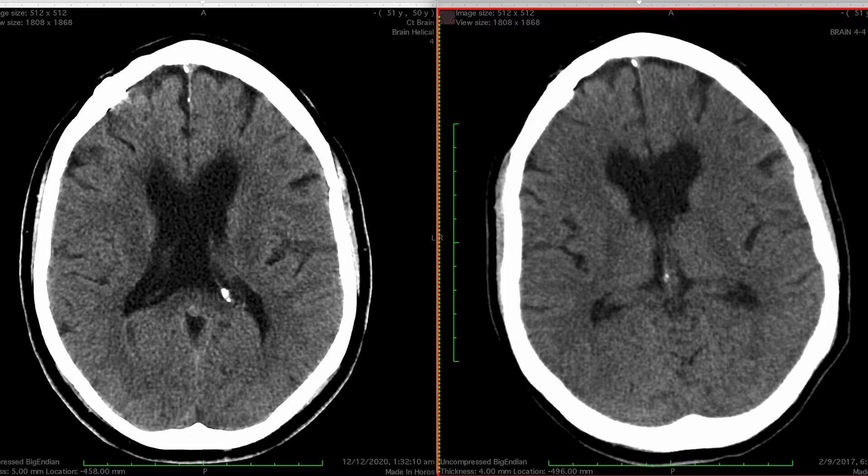Many people have CT imaging of their brains for unrelated reasons — for example, they may have fallen over and hit their head. A colloid cyst is a quick and easy diagnosis to make and can potentially save a life.